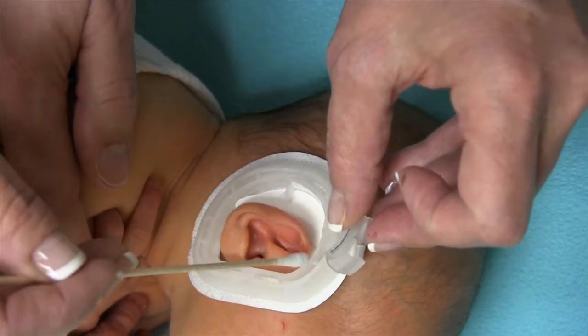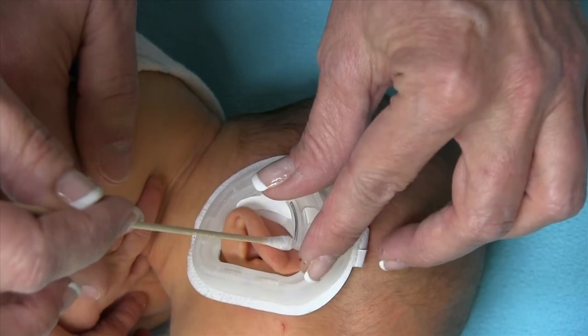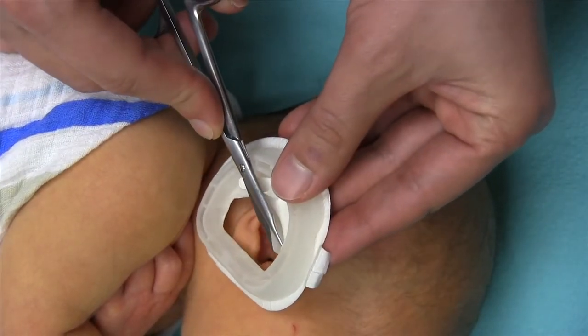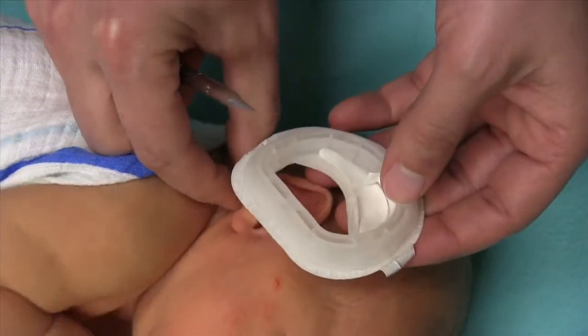I need to trim this as we've showed you in the videos. I need to trim that so we can move it up a little higher within the cradle. What I'm going to have to do first is trim this at an angle so that these are not sitting on top of each other. We're going to just clip that at an angle — that's perfect. Let's go ahead and clip that and pull that off, and that will be ready to go.